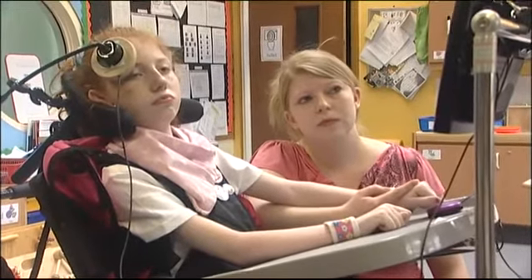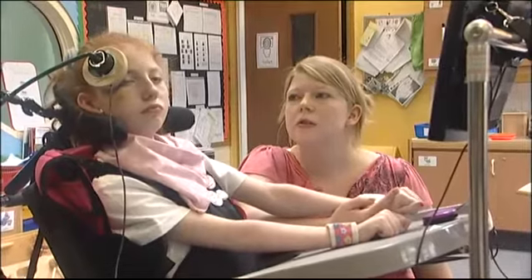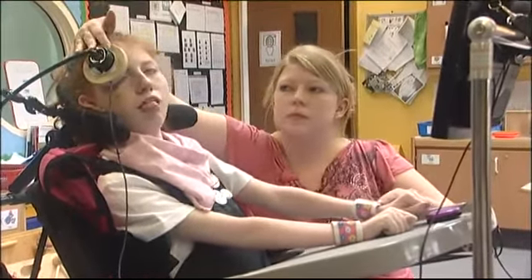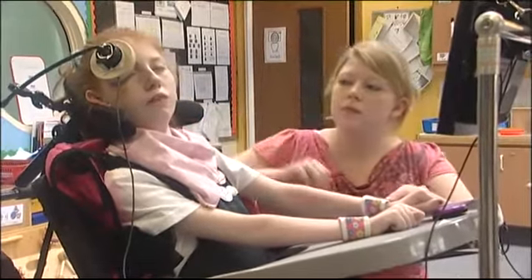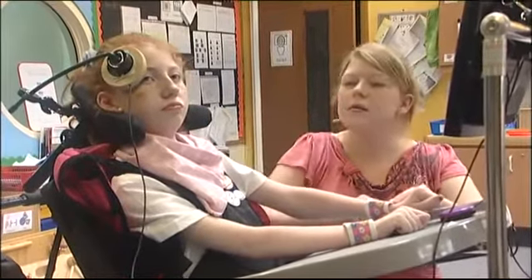So you need to look at your Dynavox. Could you find your friends page for me? Can you press your hands? Good girl, push hard. And can you push hard? Move your head away slightly, yes? That's it, and now try.